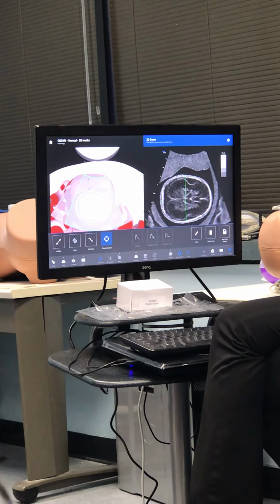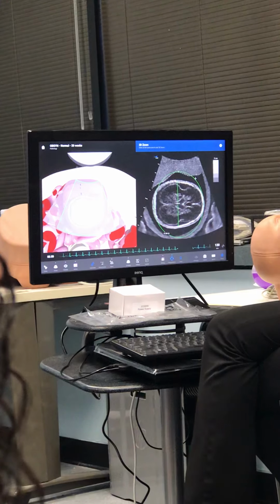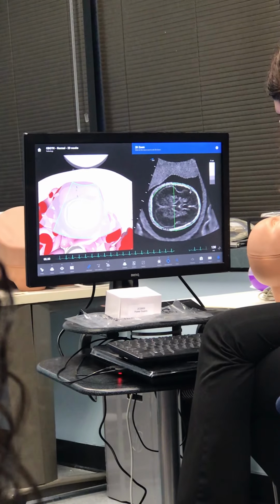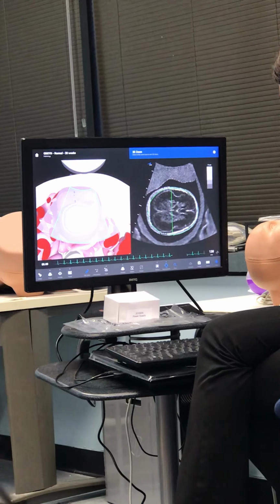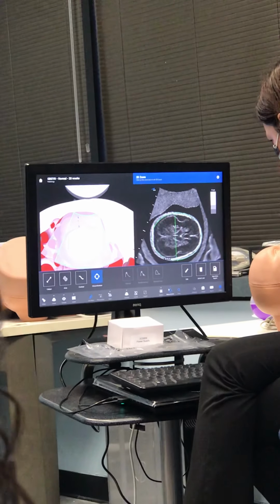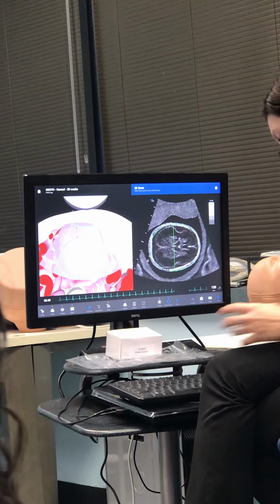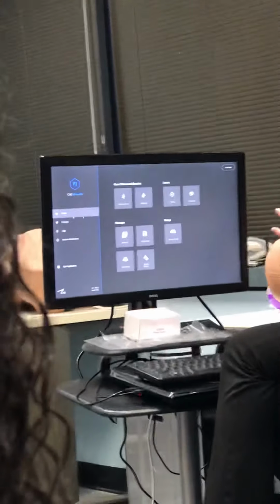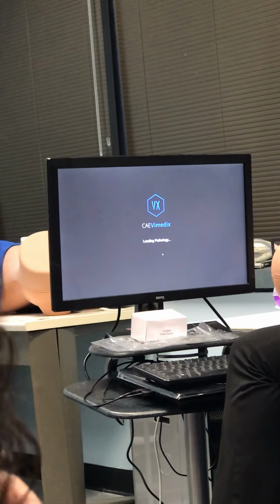So I'm going with OFD here, and then we're all going to be surprised about what happens next. Okay. You place your first ones, and then I'm sliding, and it's moving with me. Oh, can I rotate through? Is there a measurement on the measurement setting? There were boxes that you could put and move each one. That's what I'm thinking. Unless it's going to let me just grab. It is not going to let me grab. Whoa! Push it! Go back! Press whatever you pressed again. I don't know how to press these parts.